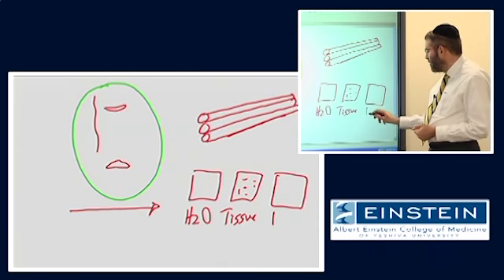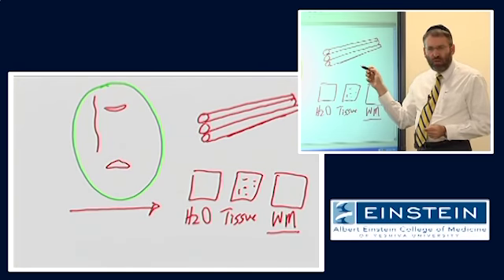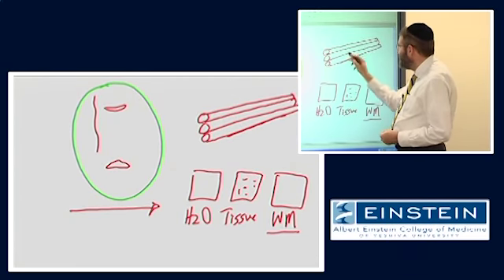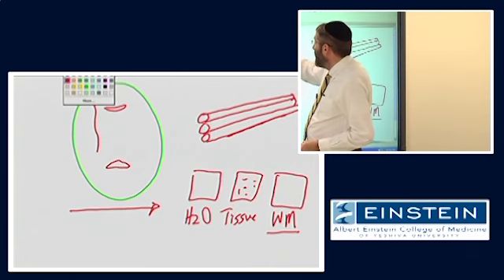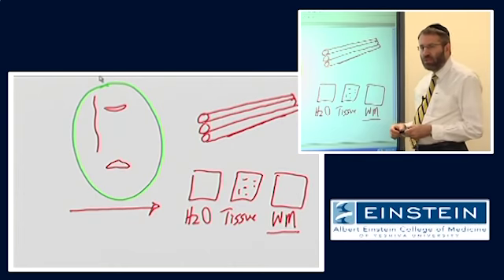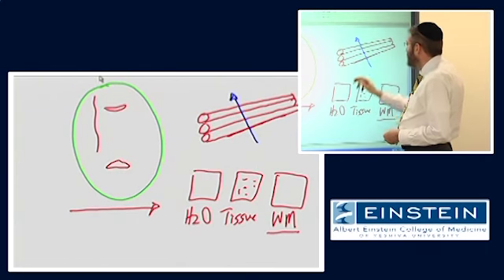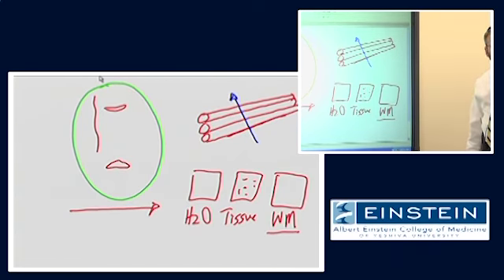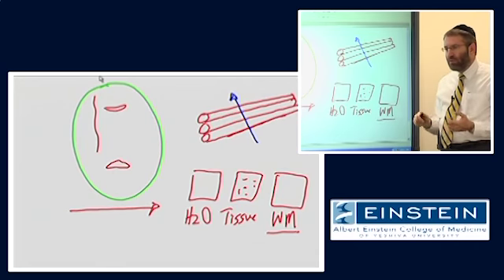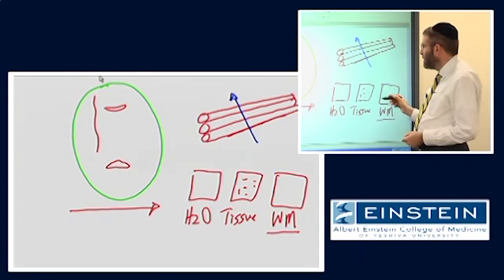In white matter in the brain, because of the unique structure of white matter, the barriers to diffusion are set up so that in this example, if we look at the likelihood of some population of water molecules and the direction they're going to move, they will have a very hard time moving across or perpendicular to the orientation of those axons or that fiber bundle, however you want to describe it, simply because of the orientation of all of these structural components.